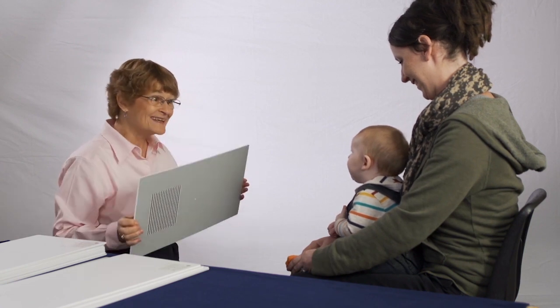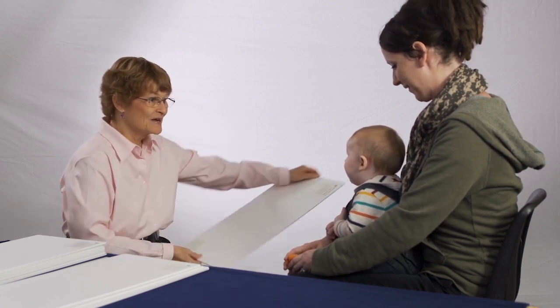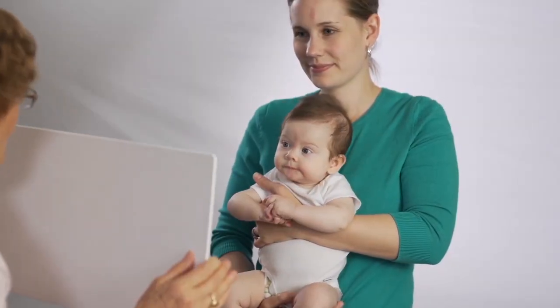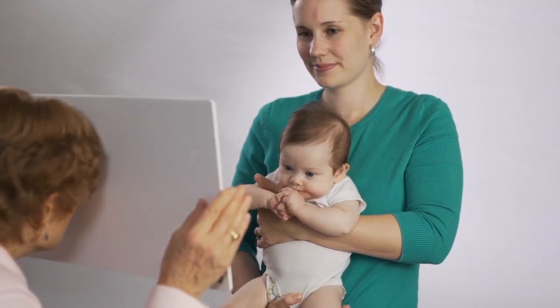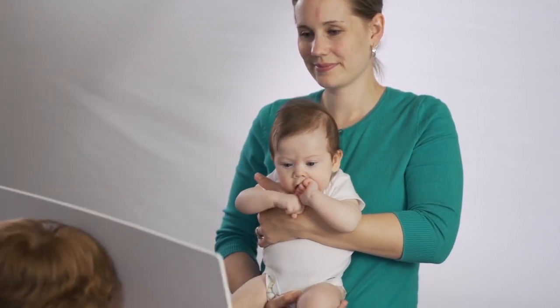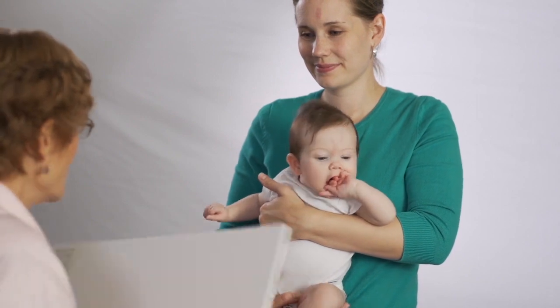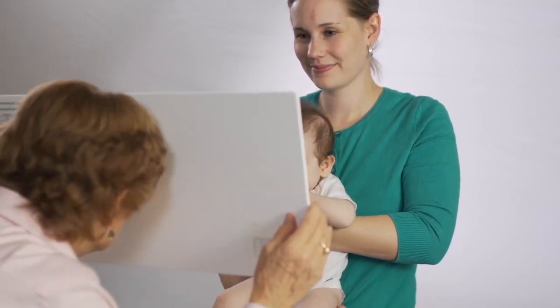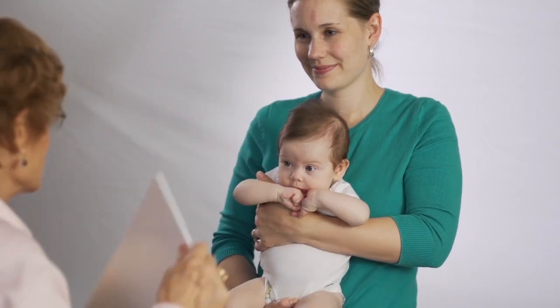Typically, the patient's responses will be definitive when the grating is coarse and above their acuity level. However, a finer grating that is more difficult for the patient to see may lead to more subtle responses and require more presentations. It is up to the examiner to determine how many presentations she needs to be confident of the patient's visual acuity.